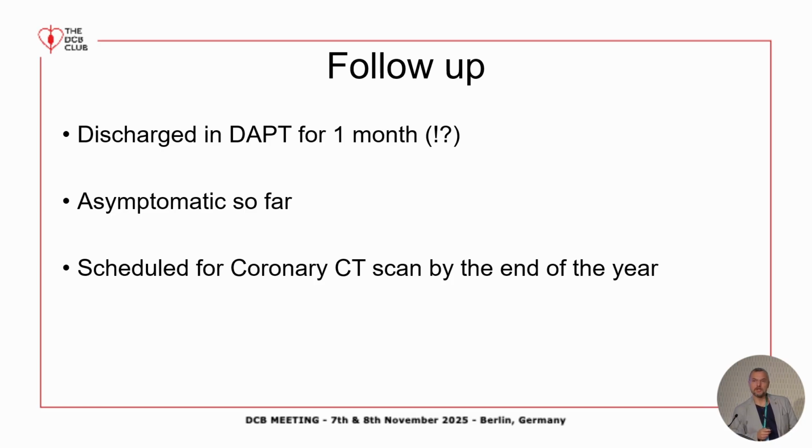The patient was discharged on DAPT for 1 month. I know the patient was non-STEMI, but this is our practice. We try to minimize the duration of dual antiplatelet therapy, even in the case of ACS. Well, where are the data? You tell me afterwards. Asymptomatic so far. So far so good. I will do the CT scan for this patient. We don't regularly do follow-up angio. We use photon counting CT scan for these patients.